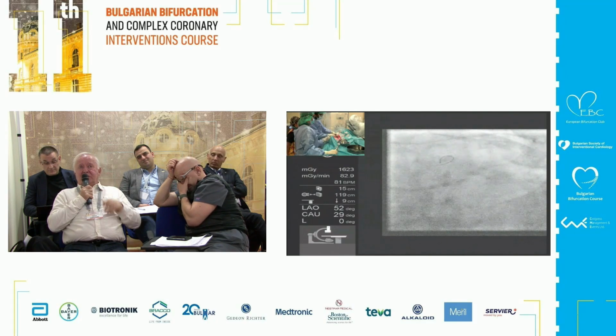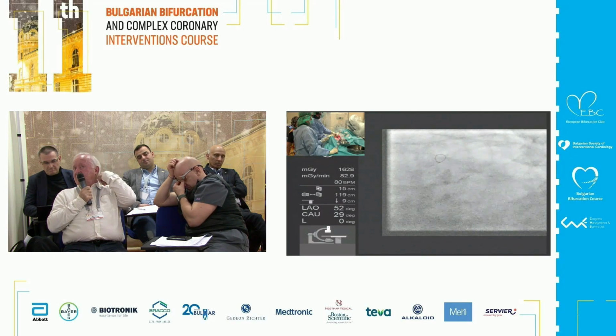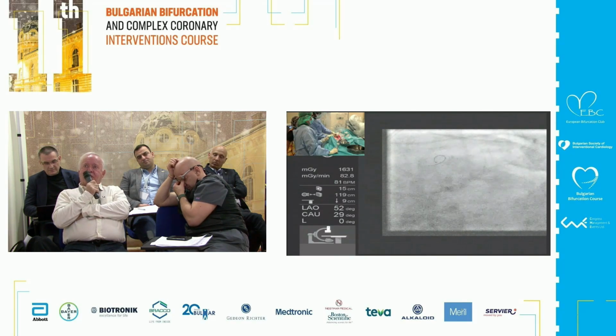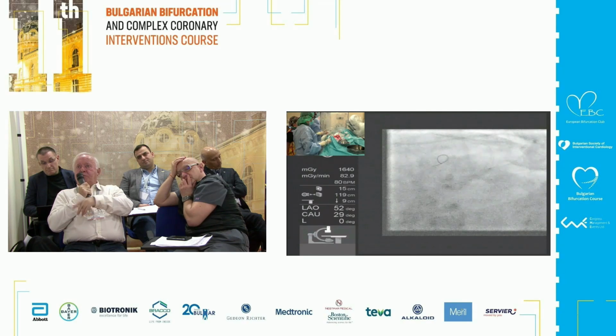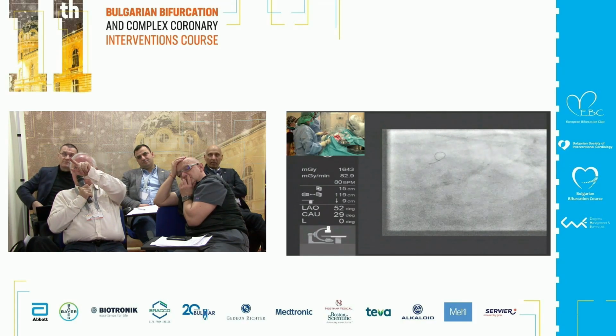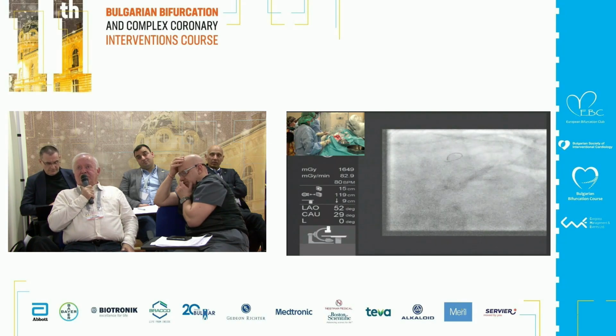I understand, because this is oval, that you don't want to add the two diameters, but there should be a rule about the size of the balloon, or not? Which balloon comes more proximal? The one that went more proximal was the circumflex, the biggest, 18. The biggest always comes more proximal. Okay, go to 14 atmospheres with both.